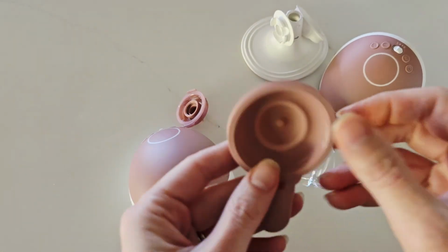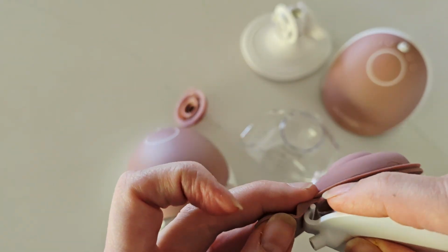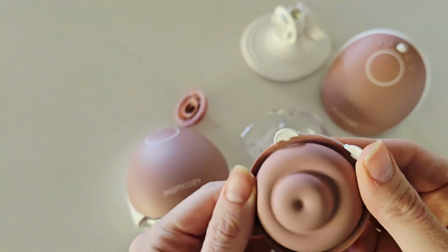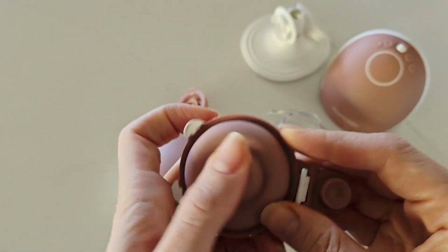Next, you have your diaphragm. Now, again, this comes in a two-part kit. I'll put it together for now. A two-part kit. This needs to be replaced every 2 to 3 months.